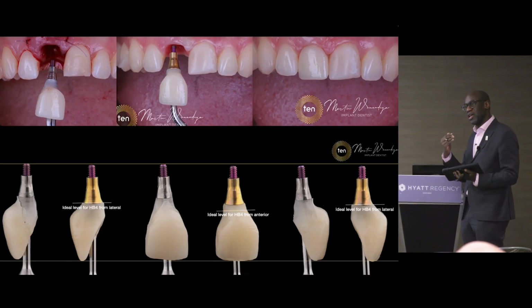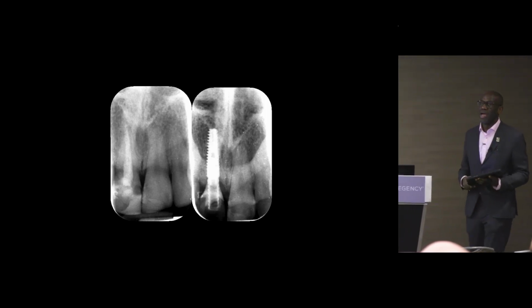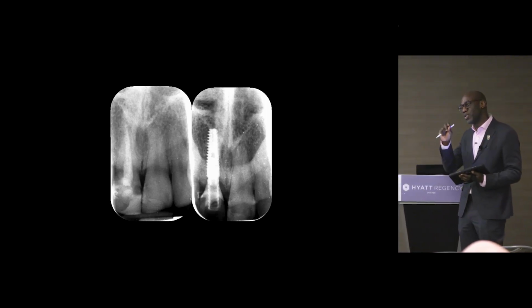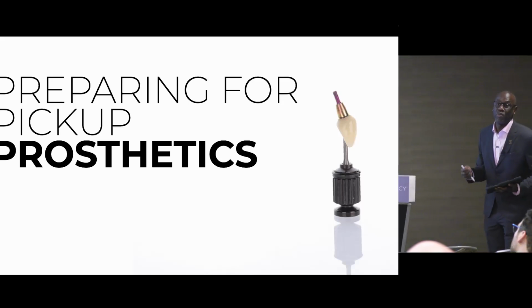So the positioning in terms of the height is also critical and key. This is why having both a long and a short angle cut is critical. If you have to move the junction up, you still are able to cut it and have enough material in and around there. It's really 1 to 2 millimeters maximum, so that you can build up the critical and subcritical contour in that area. So one of the things that we're going to talk about is workflows.